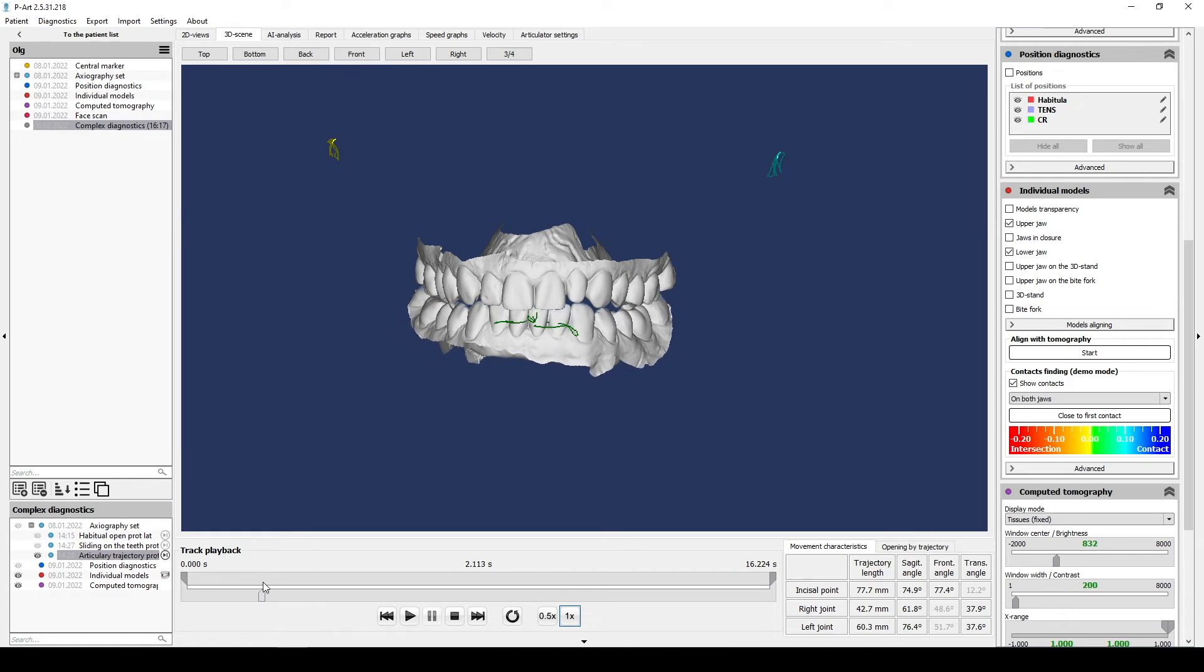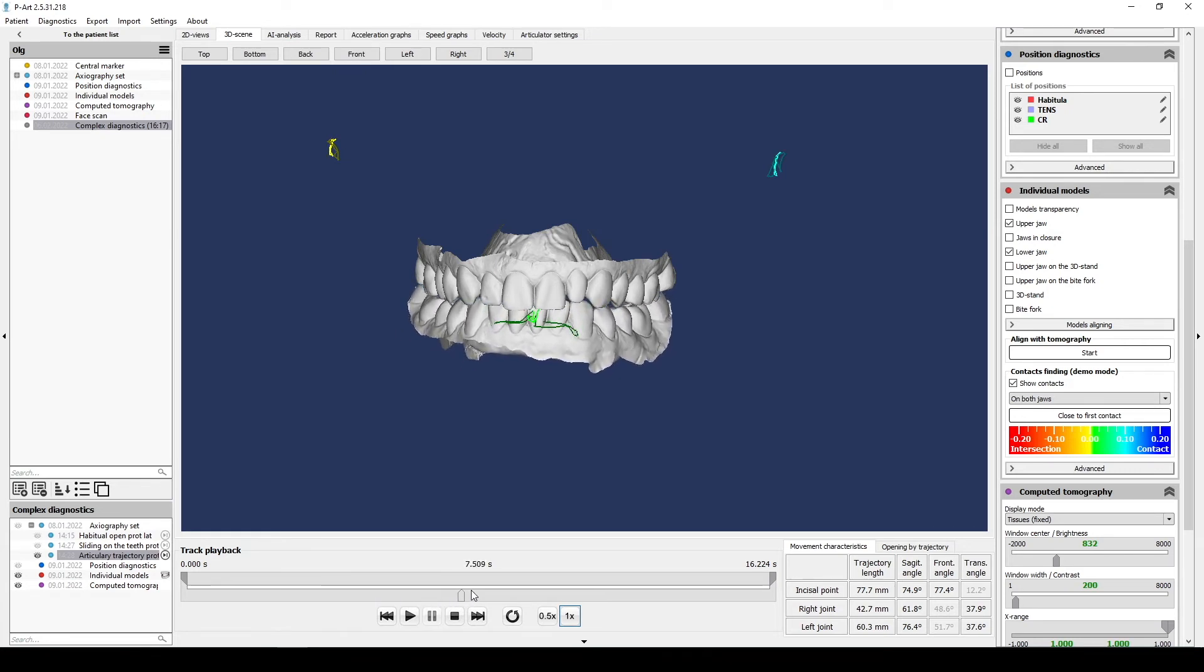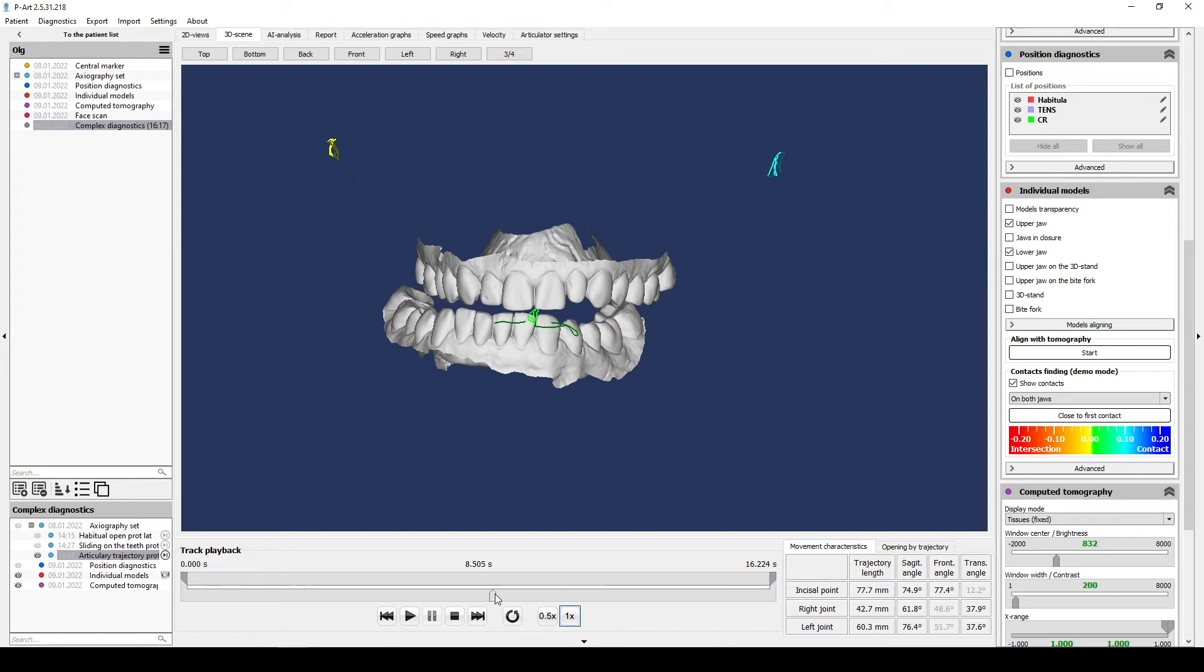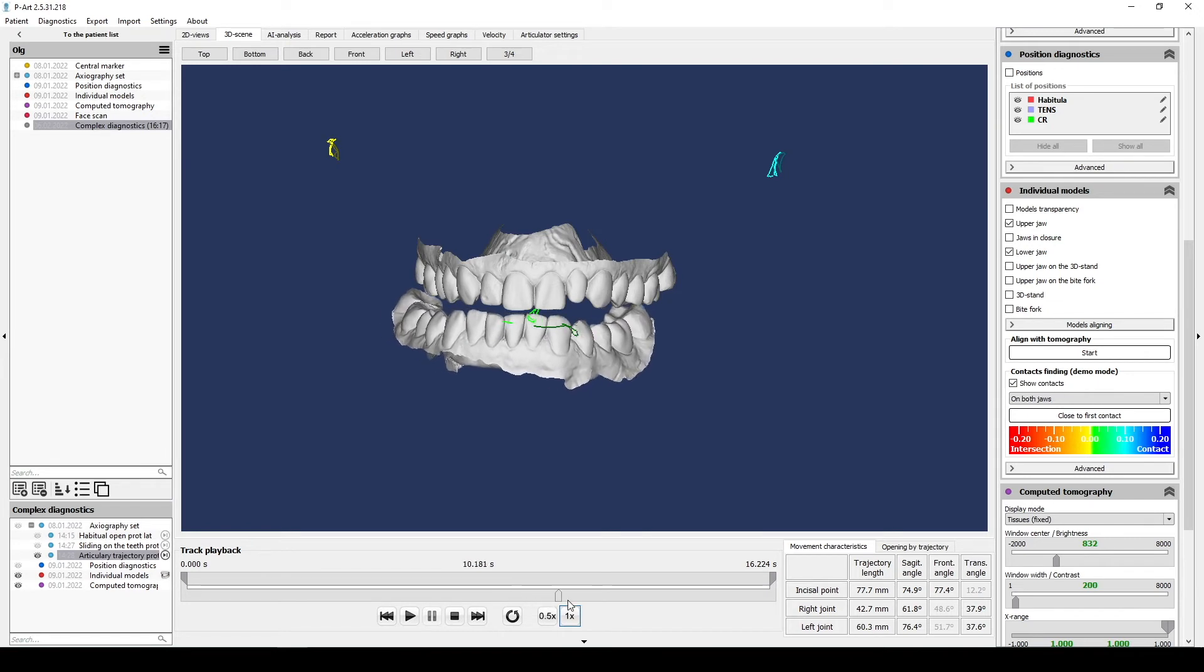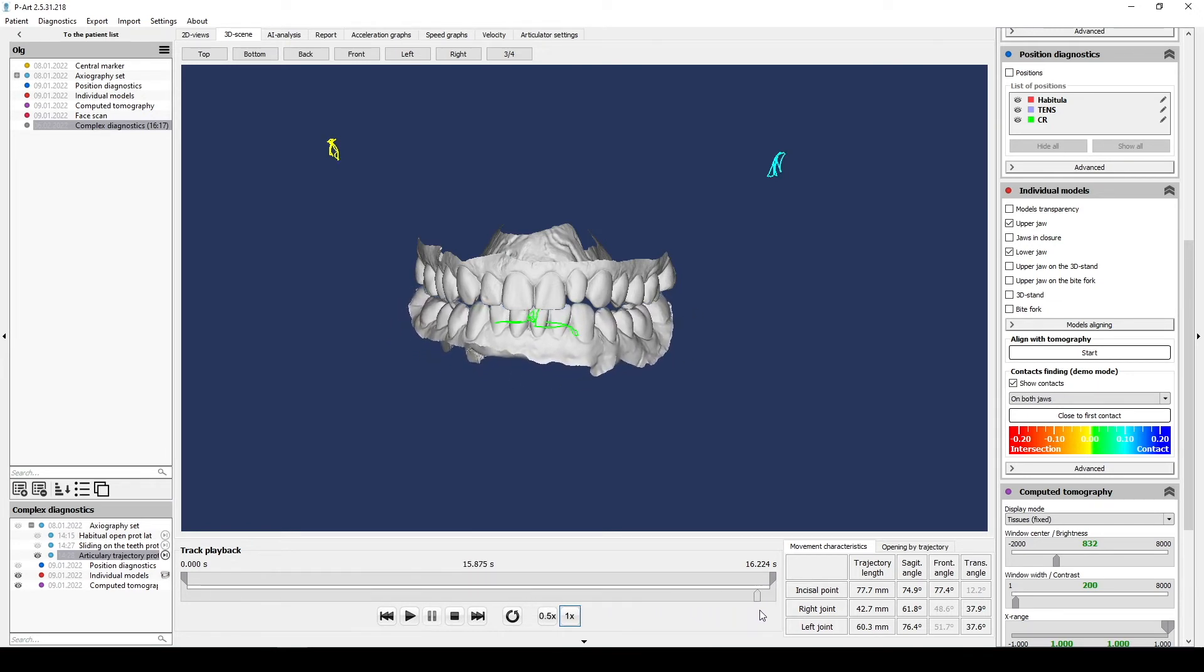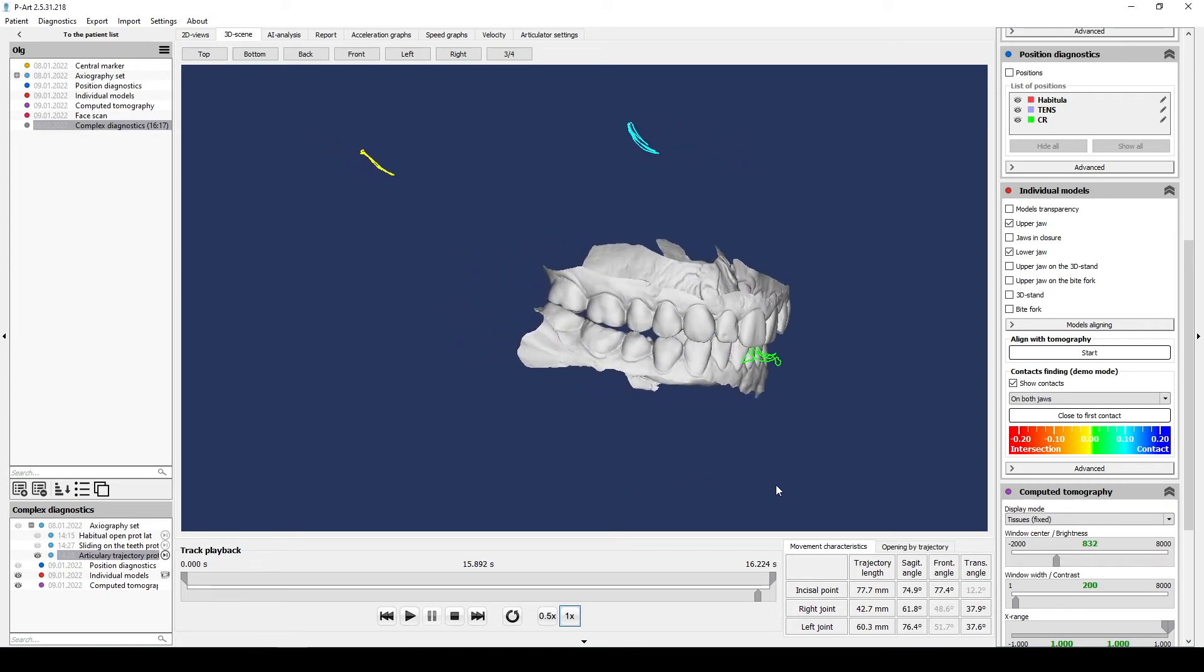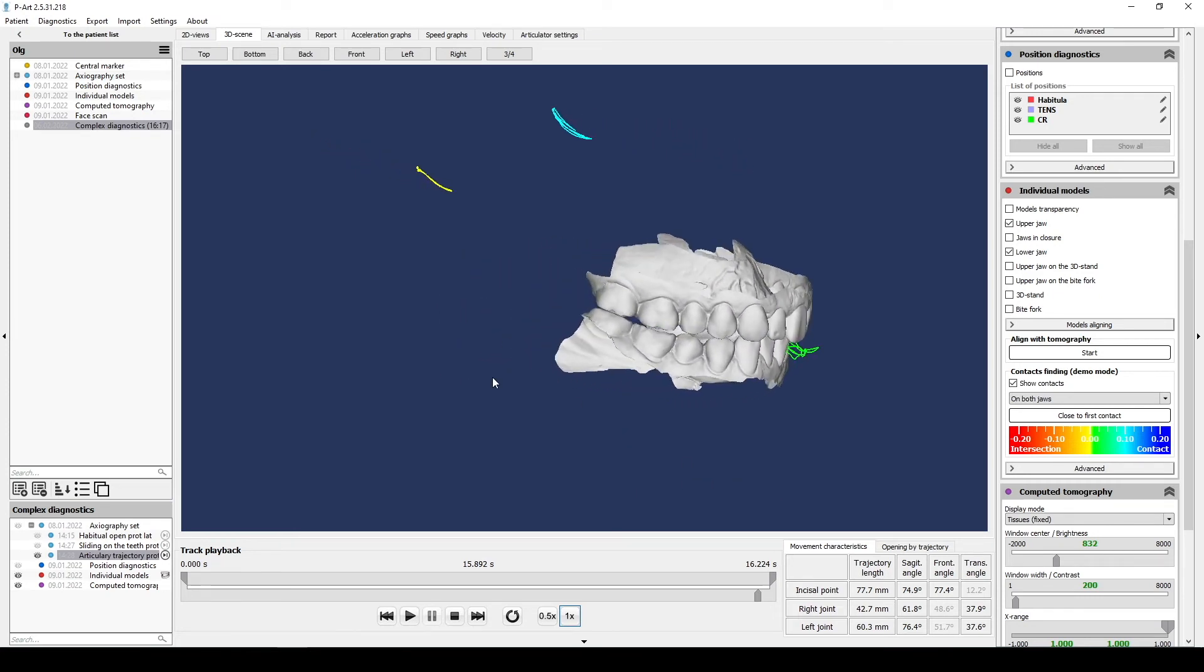This is necessary to evaluate clear joint movements and also get articulator settings. This movement gives us possibility to estimate joint movements when teeth don't influence direction. Check changes of trajectory because tooth guidance very often changes trajectories.